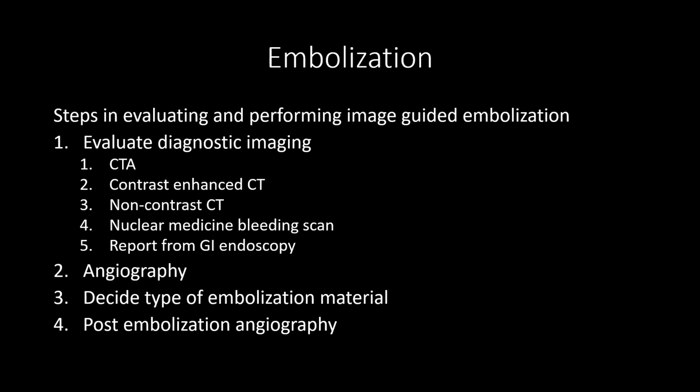So kind of the steps in evaluating and then performing image-guided embolization. So number one, we are radiologists, so we want to evaluate diagnostic images. It's actually pretty rare that we would do an embolization without pre-procedural imaging.